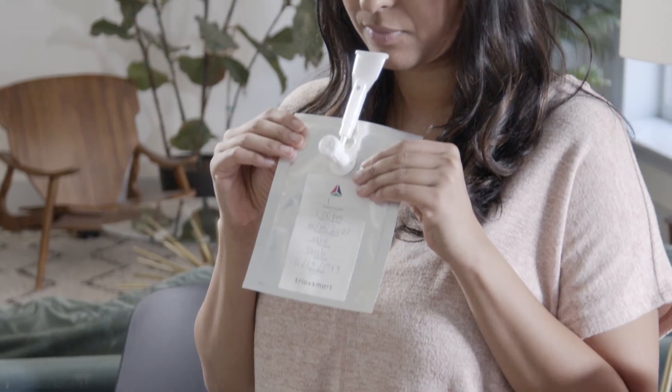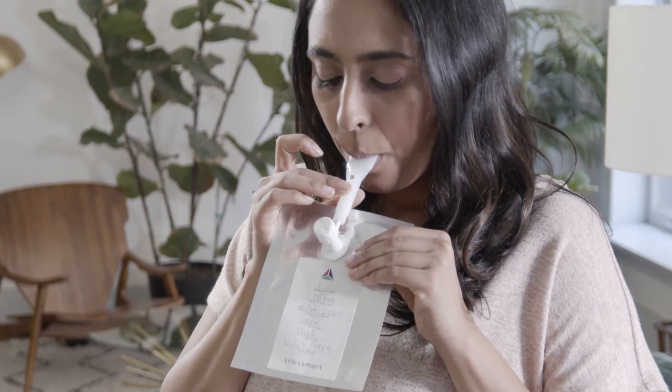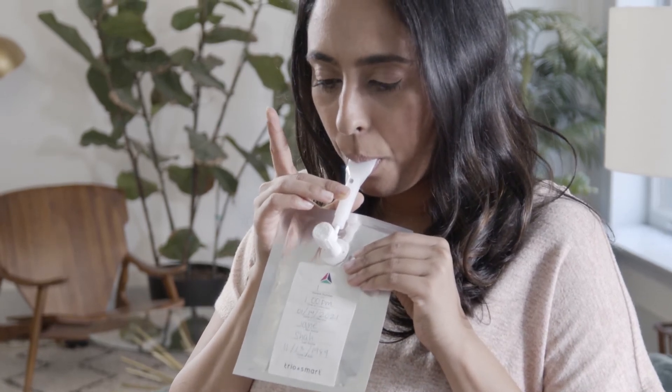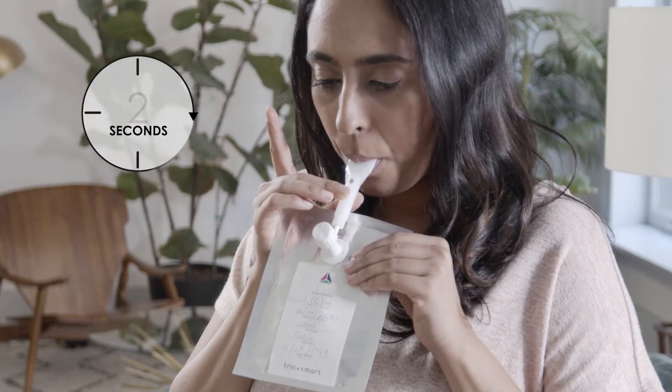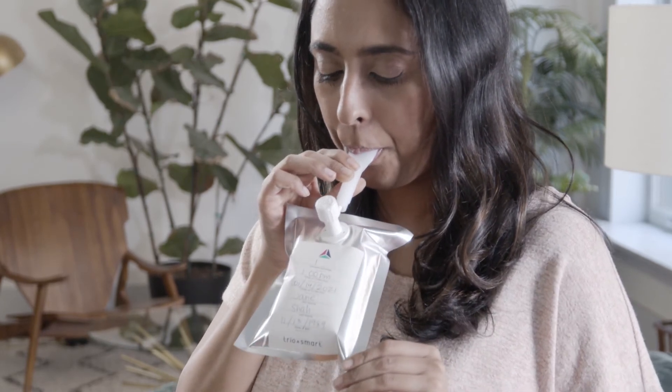Now take a deep breath and exhale normally into the mouthpiece. The air from the top of your lungs escapes from the small hole so the bag won't inflate yet. After two seconds, cover the hole on the mouthpiece and continue to exhale normally. Make sure you only exhale once for each bag.